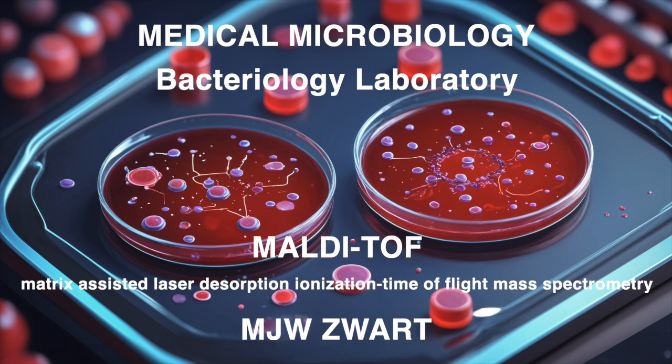What do those do? They break down those cell walls, make those proteins accessible for analysis, but you've got to work quickly during this step. Oh, why is that? Well, I'm sure you know this from your own lab work. Oh, yeah. I'm guessing it's to prevent the proteins from degrading or changing their structure. Bingo. Yeah. You don't want those proteins to break down. You wouldn't get an accurate reading.